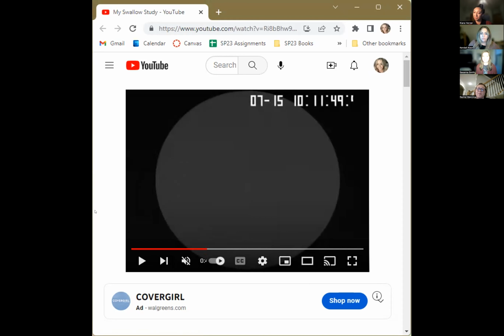Sure. You kept saying there was some residue left over. What exactly did you mean? Did I not swallow everything? So you technically swallowed the majority of the bolus, but sometimes when we swallow some things, we just have a little bit of leftover. So it's just some residual liquid or food left over in our throat. And you mentioned that you feel like you have heartburn or reflux, and that you cough a lot when you eat. So sometimes that residue can cause some of that. So it's nothing too concerning.